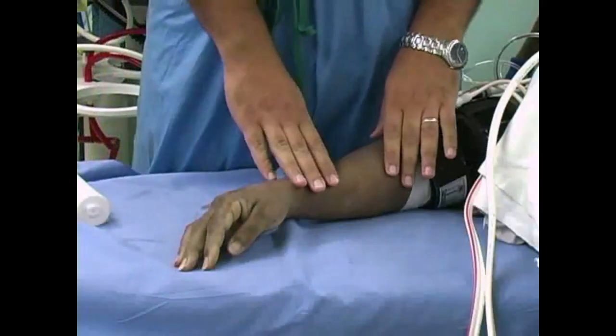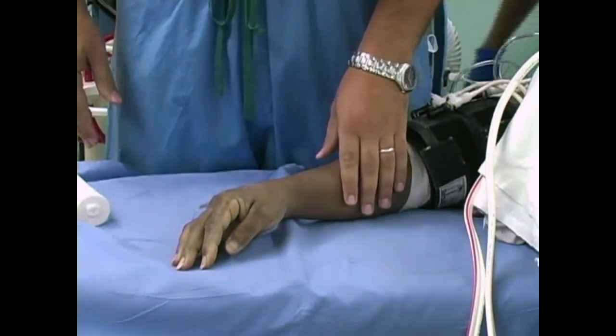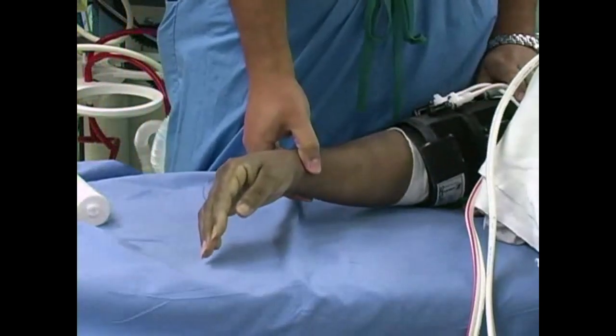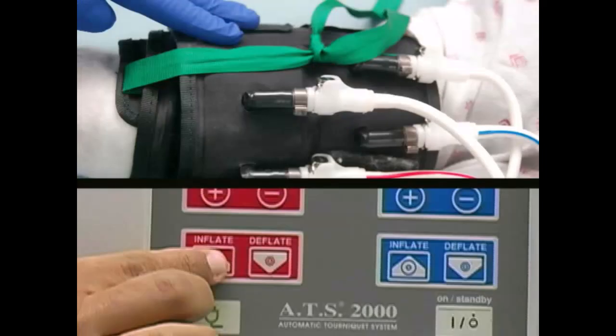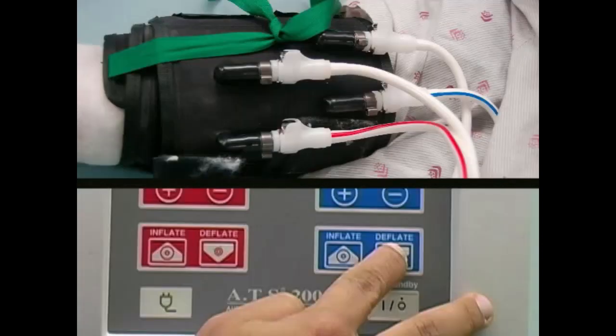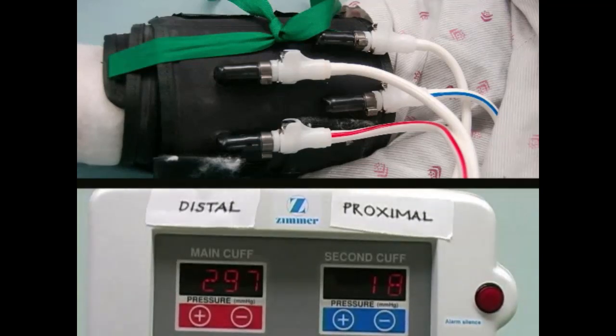Despite the best preparation, 35 to 40 minutes after cuff inflation, patients often complain of pain at the tourniquet site. Pain relief can be achieved by changing the pressure in the bladder cuffs. Inflate the distal tourniquet completely, checking the cuff pressure to ensure proper inflation. After the distal cuff is inflated, the proximal cuff can be deflated. This change provides immediate relief from the pressure of the cuff.